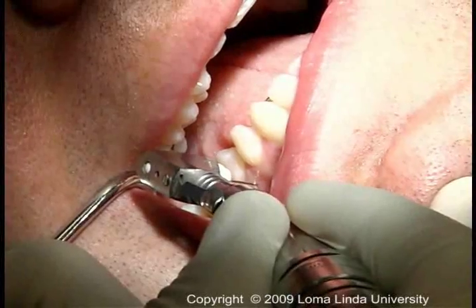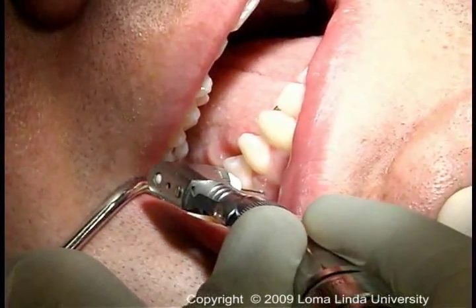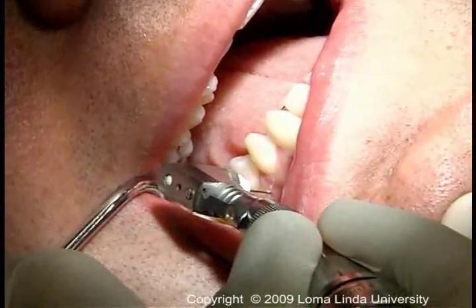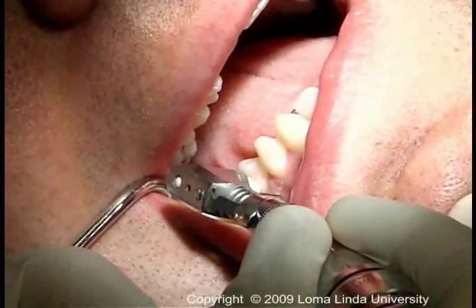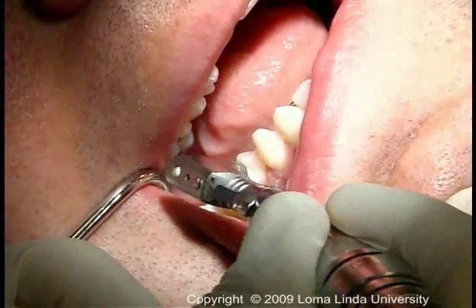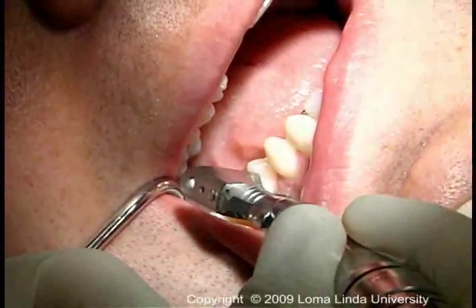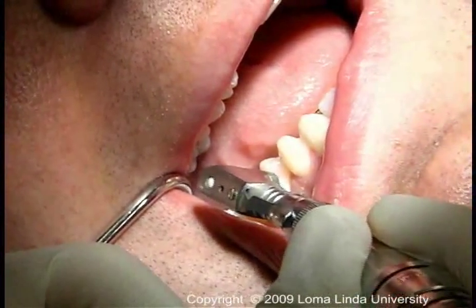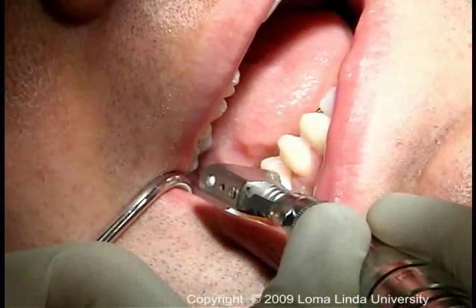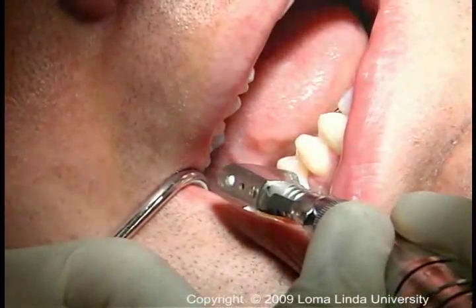The perforator, or number 2 round burr, is positioned and advanced slowly. Use alternating pressure or a type of pecking action. If the perforator is not advancing, it has become dull and must be replaced. If it is not replaced, the perforator may bind and break or create frictional heat and burn the bone.